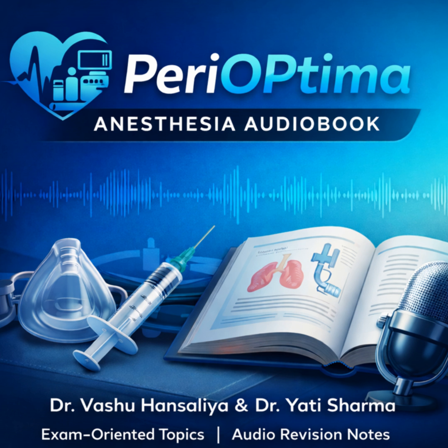Exactly. But the patient's own heart might still be beating a little bit. It's still ejecting blood from the lungs. And if the lungs are terrible, like in severe ARDS or pneumonia, the blood coming from the heart is deoxygenated. It's blue blood. So we have red blood coming up from the legs from the ECMO circuit and blue blood coming down from the heart. Exactly. They meet somewhere in the aorta. We call this the mixing cloud.